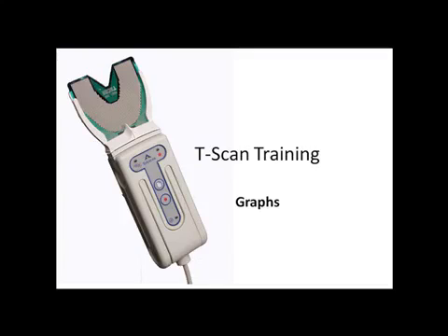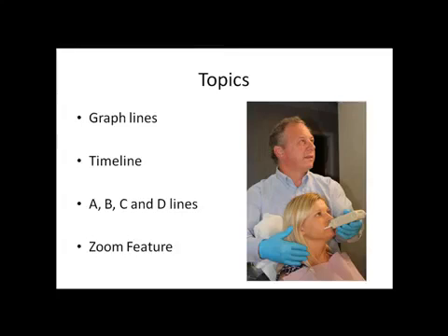TechScan presents the T-Scan training video, Graphs. This video will cover the following topics: Graph lines, timeline, A, B, C, and D lines, and zoom feature.